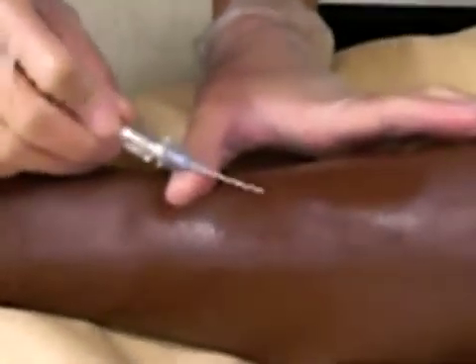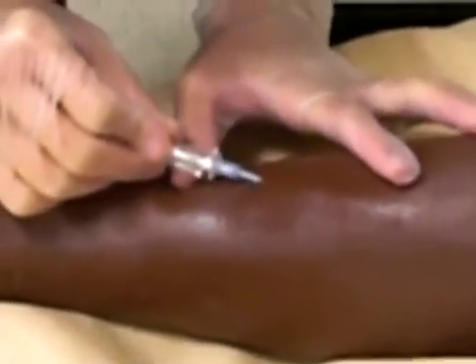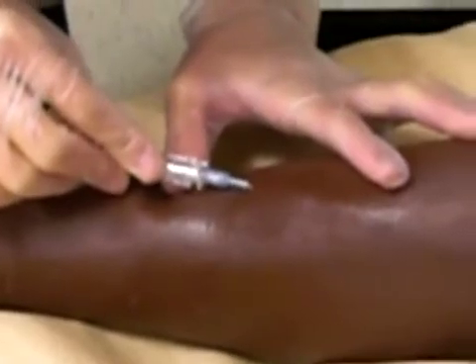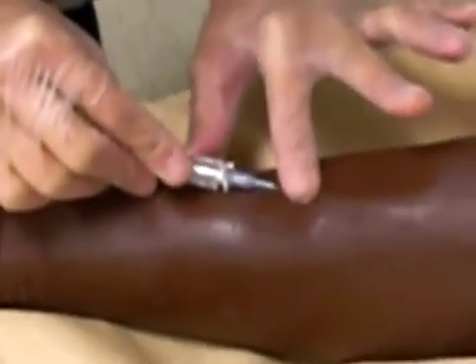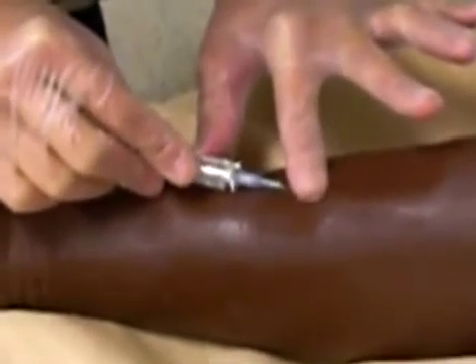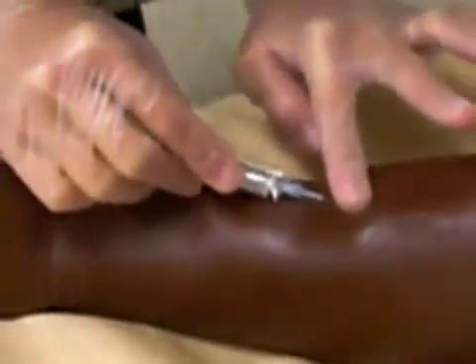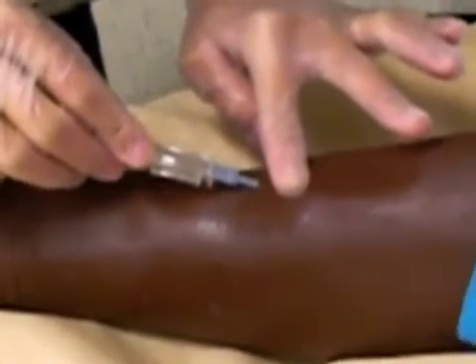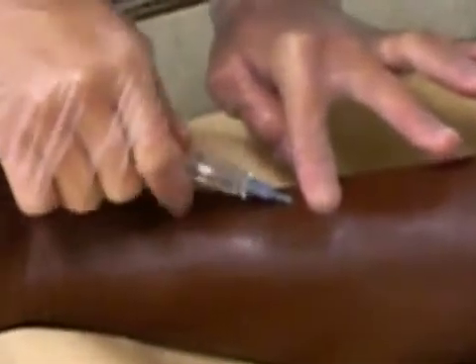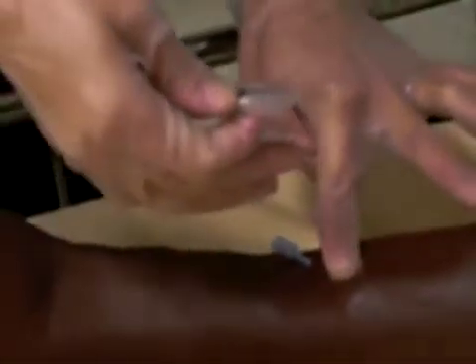The nurse observes for the blood return, and the needle is lowered while threading the catheter into the vein. She continues to hold the skin at the venipuncture site. The cannula is stabilized with one hand and the tourniquet is released with the other hand. Gentle pressure is applied above the insertion as the stylet is retracted. Sharps are placed in the sharps container.